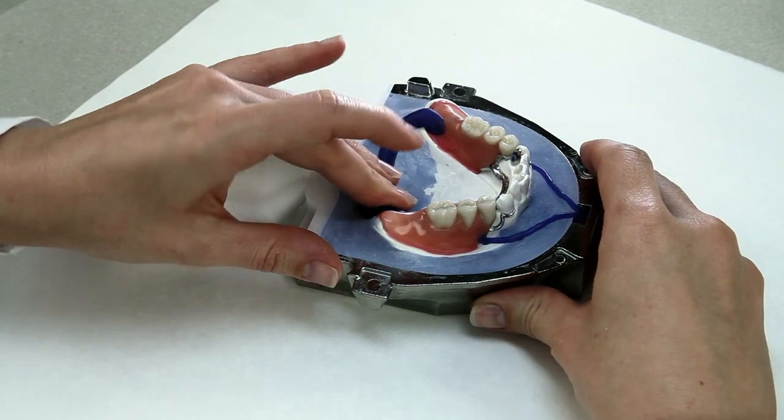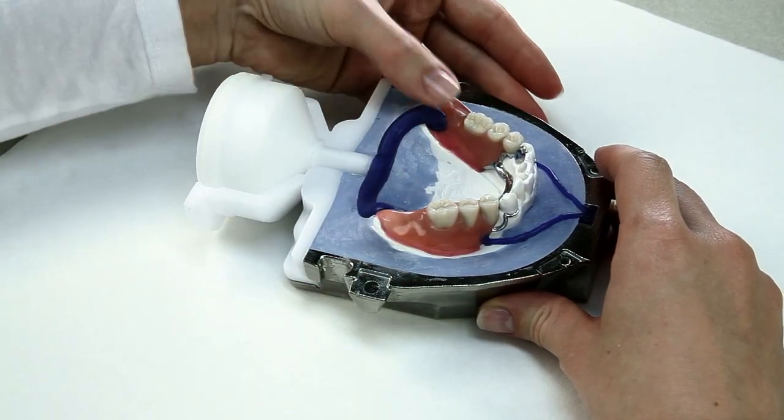The denture saddles of partial dentures are provided with a sprue each at the dorsal ends.